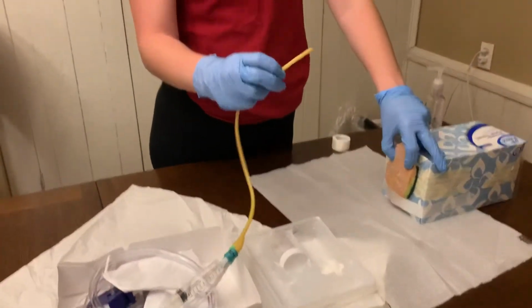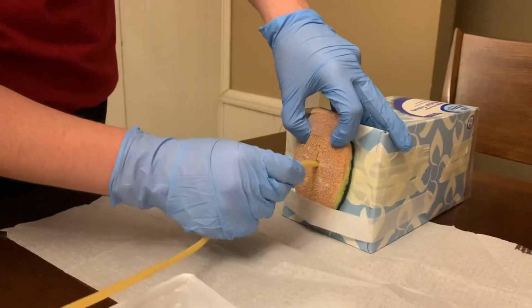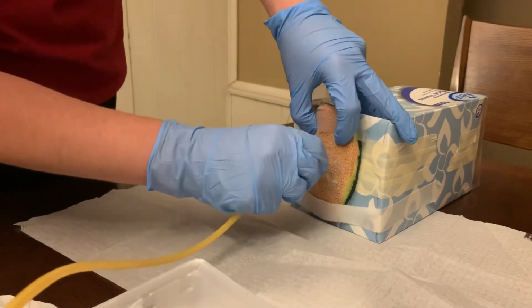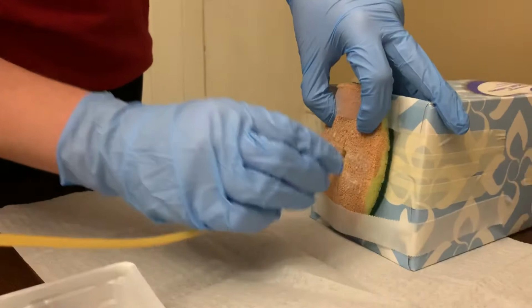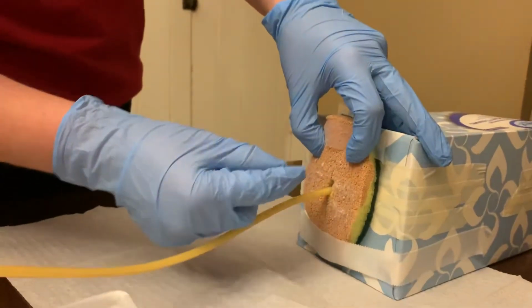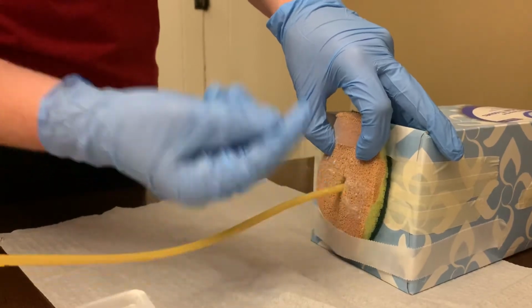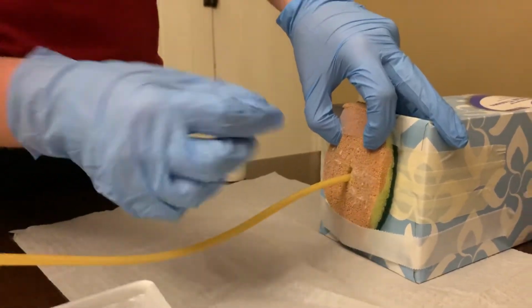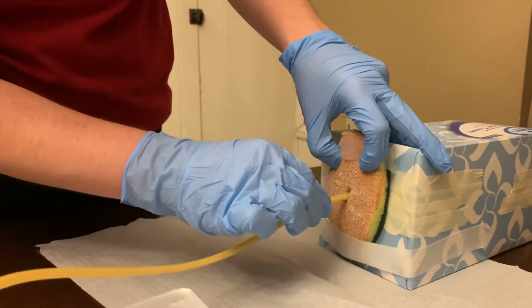And again, grab my catheter 2 inches from the tip, and hope that I can find my hole again. Okay, I found my hole now. And I would like to note that this hand touched the meatus itself, so it would be contaminated. But I would try my best not to, but finding that hole was a little bit difficult.